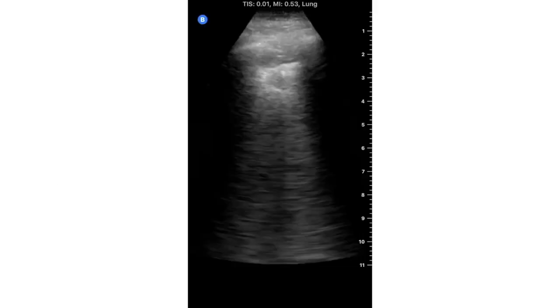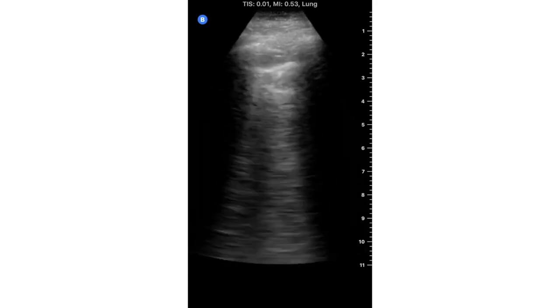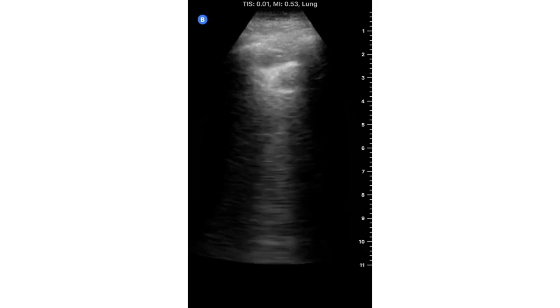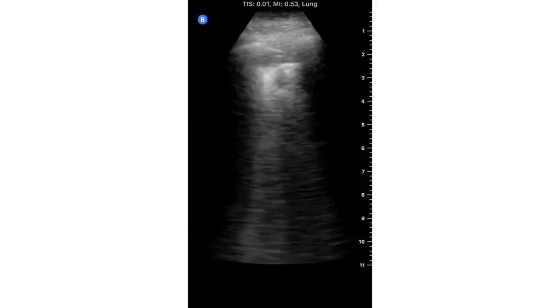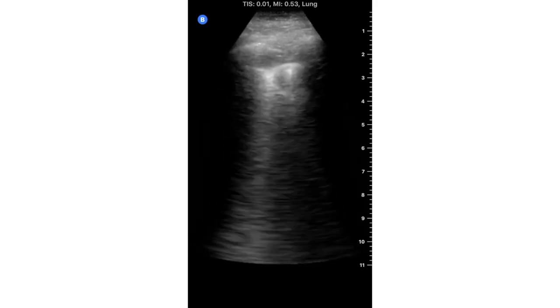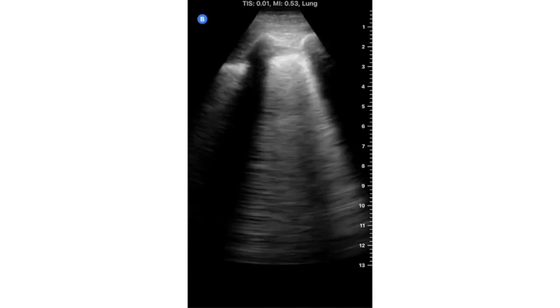The next pathology that you'll begin to see are B-lines. B-lines are these bright lines that you're seeing from the pleura that come all the way down. It is felt that any more than 2 is pathological. Now there are lots of causes for B-lines, not just ARDS, but also pulmonary edema. Remember, in pulmonary edema, the pleura will be nice and thin, and you tend to see it at the bases. B-lines essentially correlate with Kerley B lines on a chest x-ray. Here are some more examples of B-lines, and you can see they're increasing in frequency.